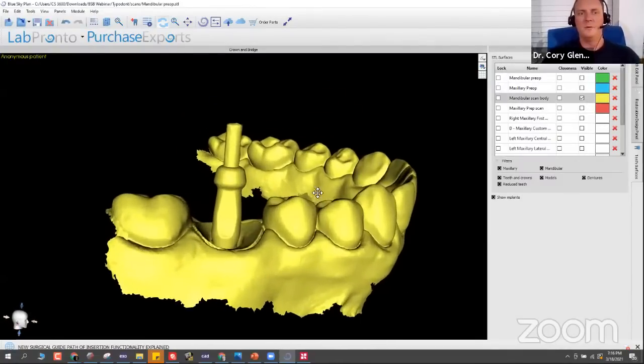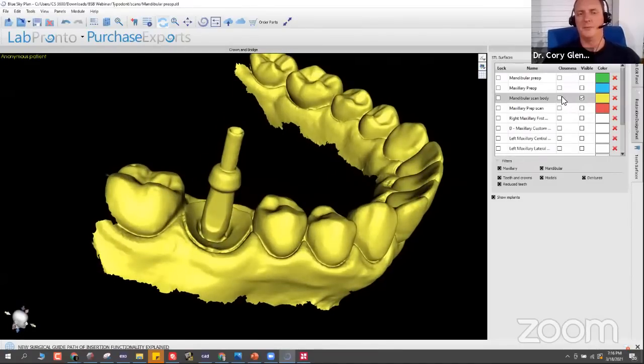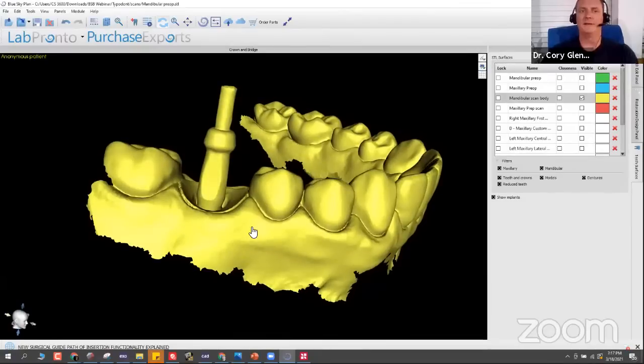Now, what you'll notice here is, if you looked at the pre-op mandible, this was just the edentulous site. What I've done now is placed an implant into that Typodont and then stuck a scan body on it. And if that scan body looks familiar, it's actually the same object as the open or closed tray impression transfer. We've now made those where they all control the timing, so they're consistent one to the other. And they're blasted, so they're still color-coded, but they'll pick up easily in an intraoral scanner. So that single part can be used as a conventional impression transfer or as a scan body.